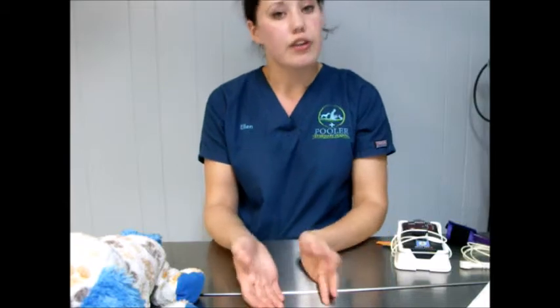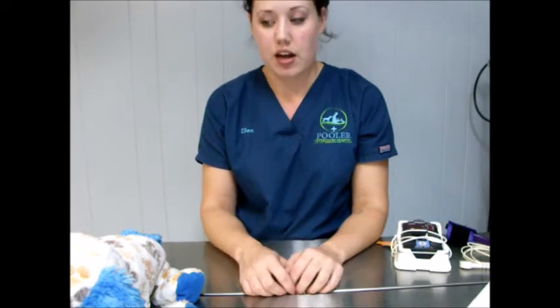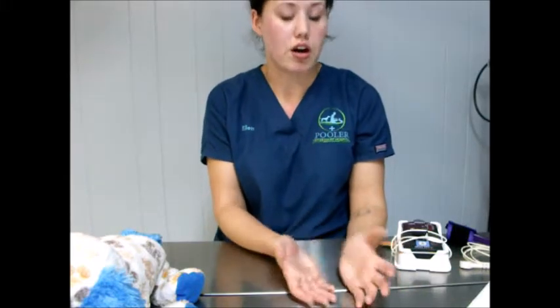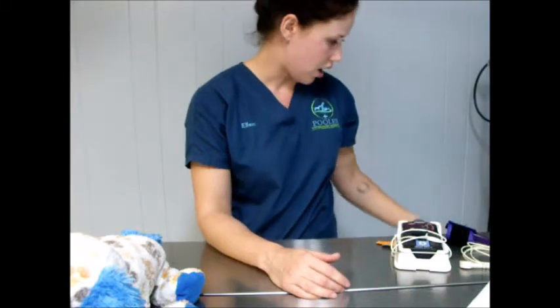You want to look out for those jumps in heart rate that can indicate pain potentially. Severe decrease is also obviously dangerous, and of course we also have the problem that a lot of the anesthetic drugs we use decrease heart rate. So then of course we move on to heart rhythm. That would be something that our EKG is going to tell us.